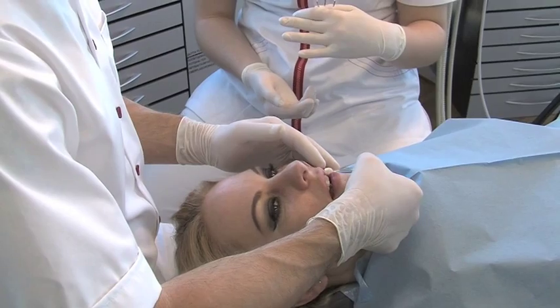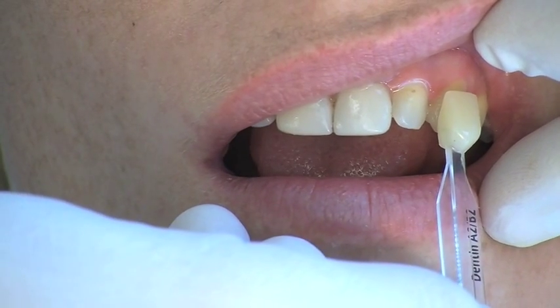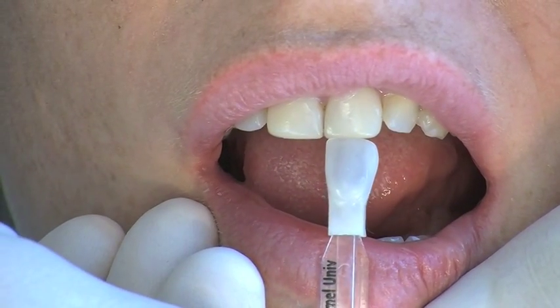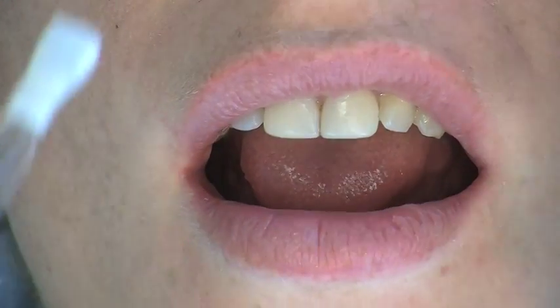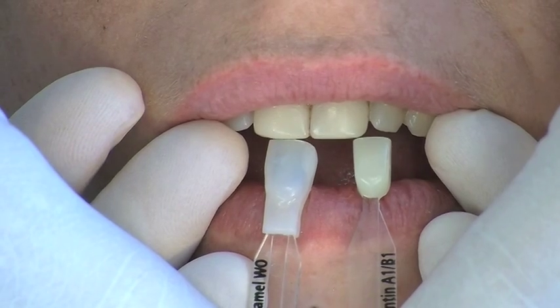Before the preparation, the dentine and enamel shade are determined cervically and incisally respectively on the teeth using the shade guide. The interplay between dentine and enamel can be determined by placing the shade guides on top of each other.